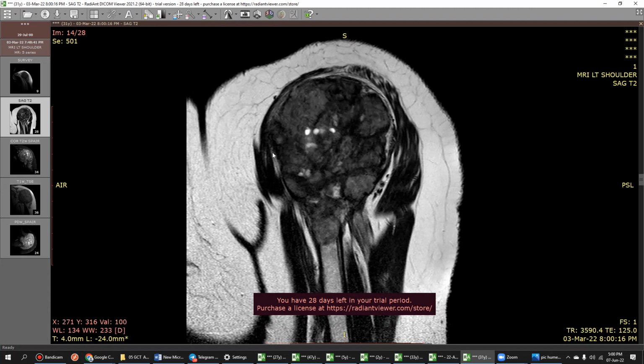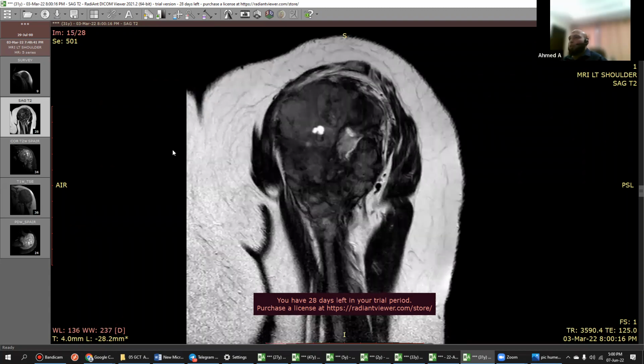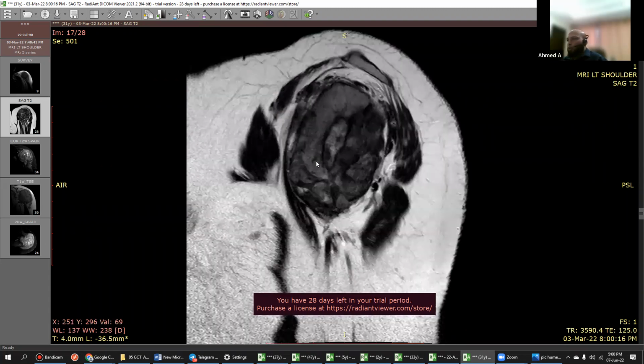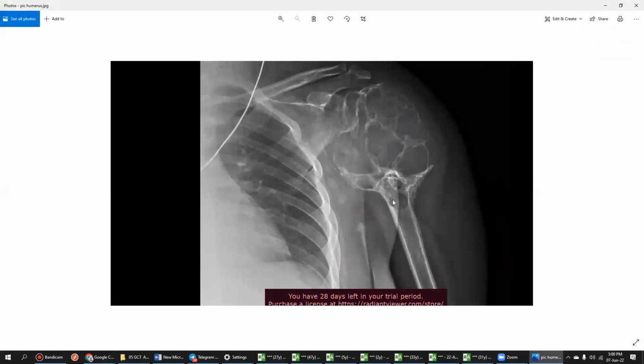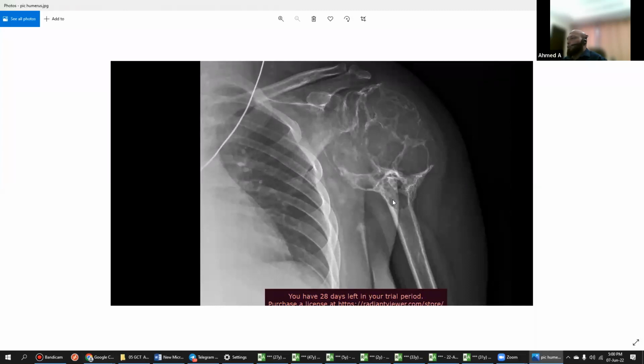Okay, fine. We have 5 minutes to start discussion. You're fine in the MRI. In the X-ray, I would have recommended you to describe everything. Did you describe the transition zone? I don't think so. Transition zone is very important. Always remember, whenever a skeletal MRI is there or a bone tumor MRI, there are wide things.